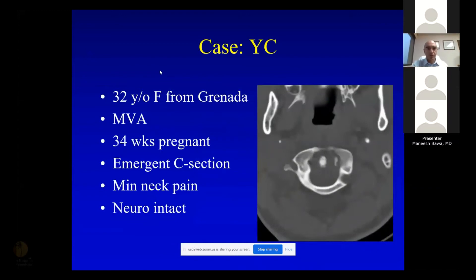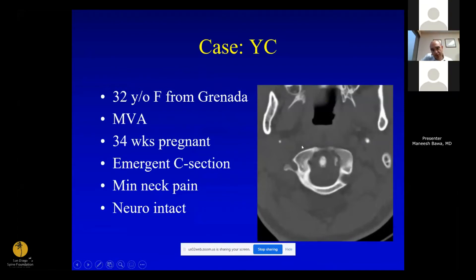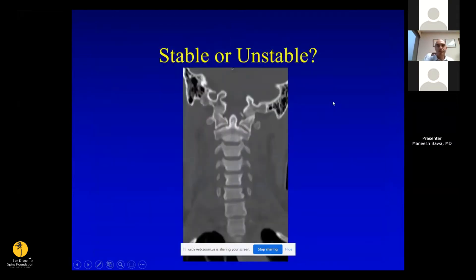We'll talk about upper cervical spine injuries. This is a lady involved in a motor vehicle accident who was pregnant and had an emergency C-section. On axial CT through C1-C2, there's increased ADI greater than 3 millimeters and an avulsion fracture off the medial aspect of the C1 ring. Sagittal views show an avulsion fracture of the inferior ring of C1, posterior widening between C1-C2, and the C1-C2 joint is in kyphosis. On coronal view, there's another avulsion fracture off the occipital condyle.